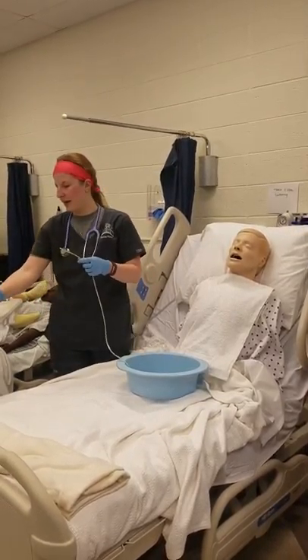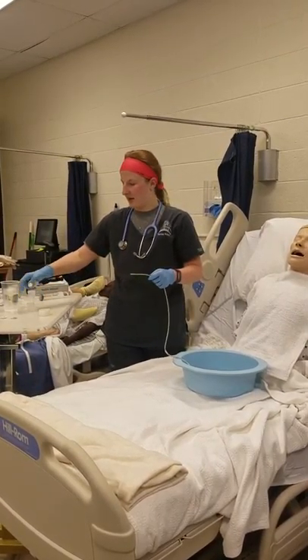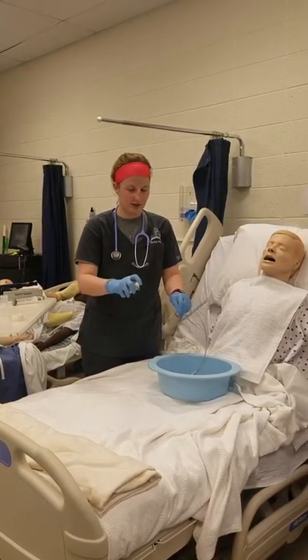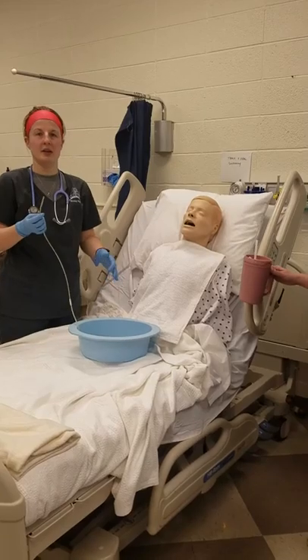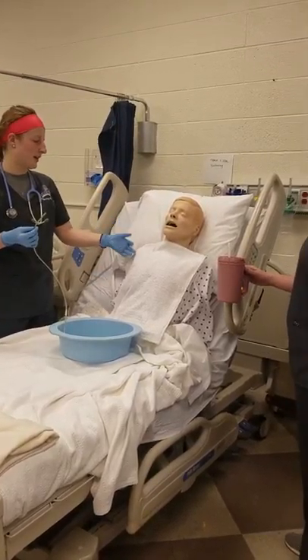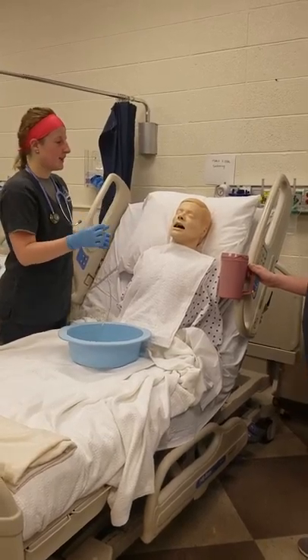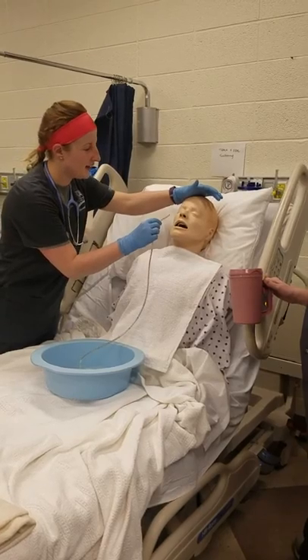I'm going to go ahead and lubricate my tube with lube about 4 inches. I'm going to have a bucket for any residual that possibly comes up, and I also have a towel in case anything messy comes up. I'm going to have him in high Fowler's position with his head all the way placed back, hyperextended.